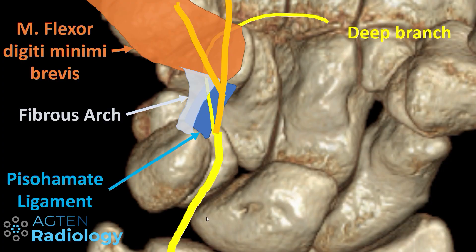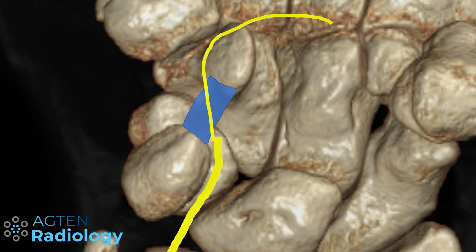If the question is for a deep branch, superficial branch, or combined ulnar nerve pathology — like distal ulnar nerve neuropathy — you have to go through all these branches to see whether there is something obvious. The deep branch, once passing on the ulnar aspect of the hook of the hamate, courses radially into the depth of the wrist, with a corresponding artery branch running along it, below the flexor digiti minimi brevis muscle. On a coronal view you can see the hook of the hamate and the pisiform with the pisohamate ligament, which is sometimes better visible on sagittal.